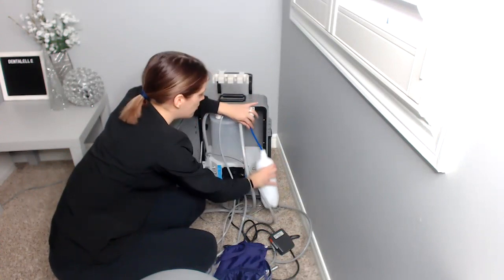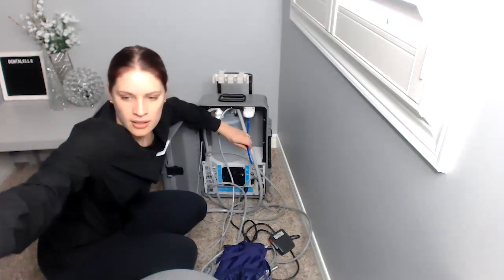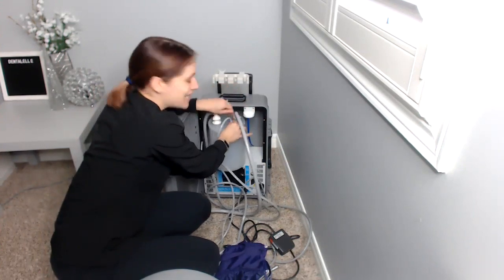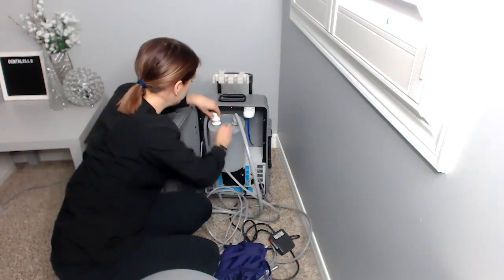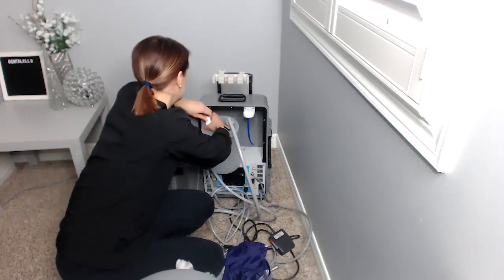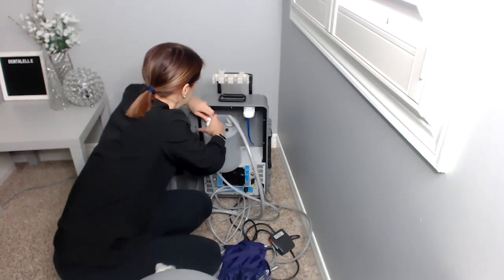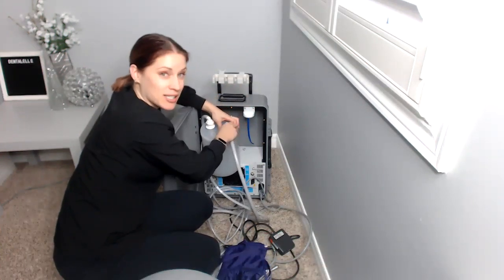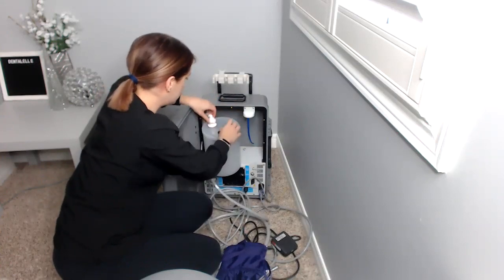Turn it counterclockwise to take it out. Put the water bottle on the table there. Take out the slow speed hose. Take out the unit hose. It's kind of finicky sometimes. Actually, you know what? It's probably just because this isn't down all the way.